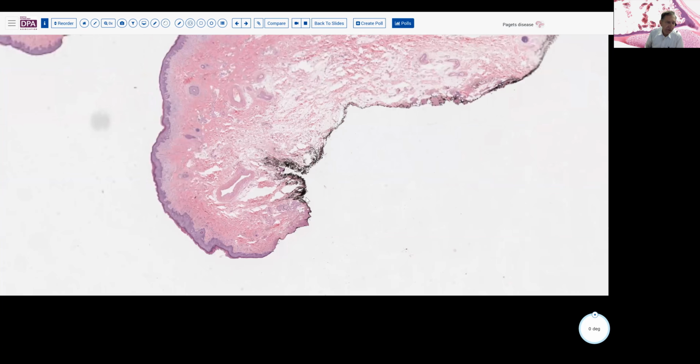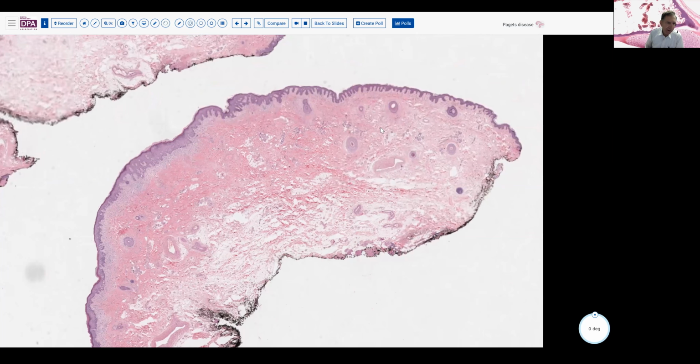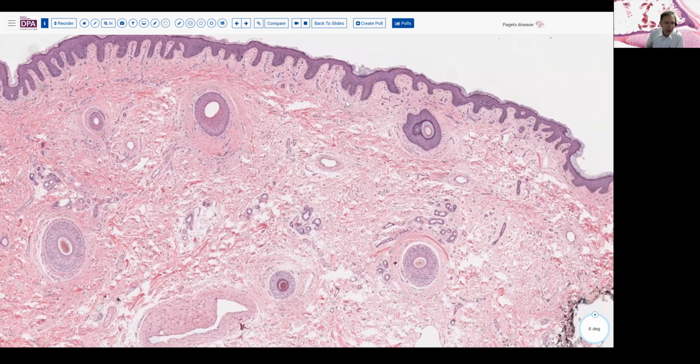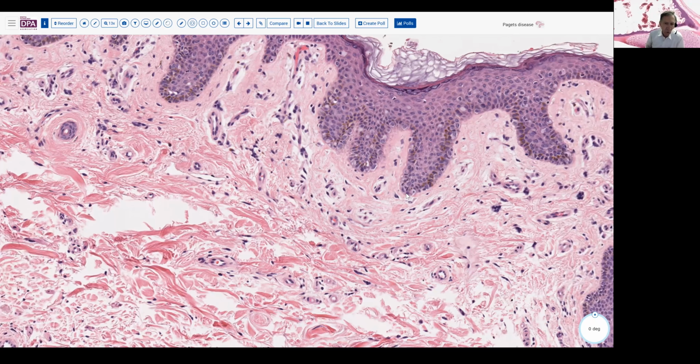Of course, in the vulva, it's not always just what they can see, it's also the anatomy. And so as we look here at this other side, the outer side where you have more hair follicles, here, it's more difficult to identify whether there's positivity or not. But I think you can even see here, there are a few of these very funny looking cells out here, well beyond the probably clinically visible lesion.